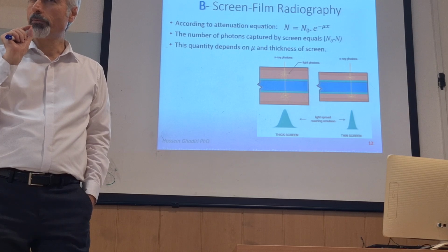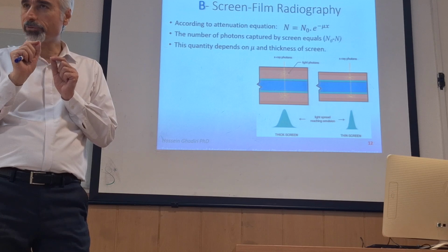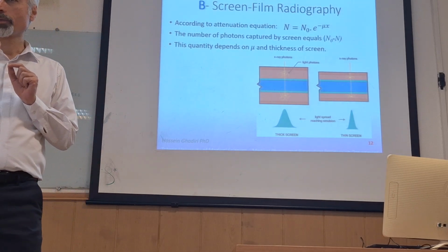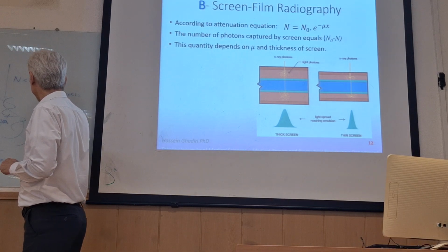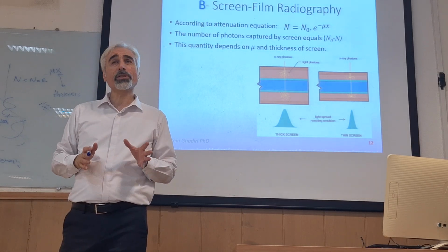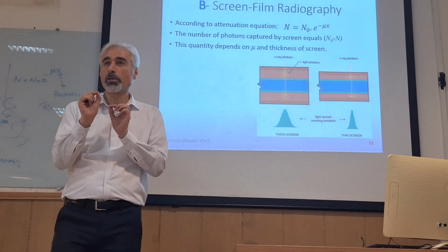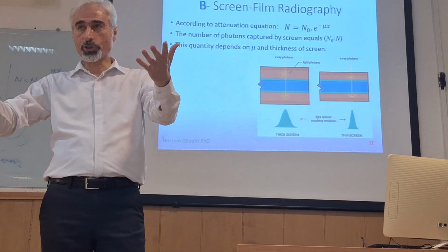A colony of calcium atoms makes very small dots of calcium. We call it microcalcification. It's very important in mammography imaging. We see these very small calcifications, so we need high resolution imaging.